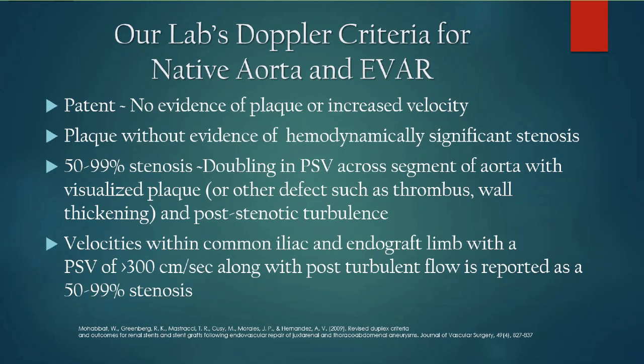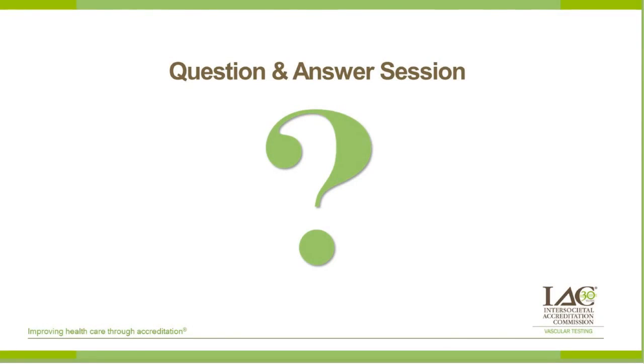All right. There's questions about, when you're doing this procedure, do you ever take time to evaluate the kidneys or the lower extremities or the ABI or any additional parts of the system? Well, another great question. If it's an EVAR, an endovascular aneurysm repair below the renals, we're evaluating a normal aorta. If the ordering physician requests ABIs, we would of course do them, but it's not routine. We don't schedule studies that aren't ordered.